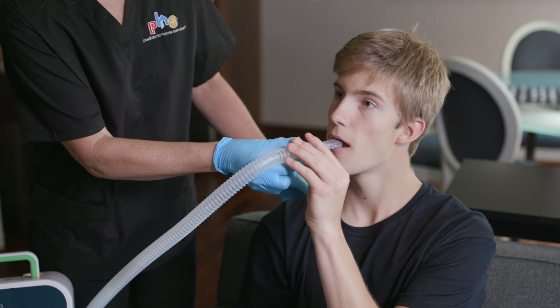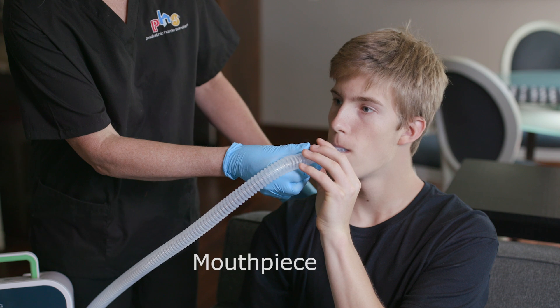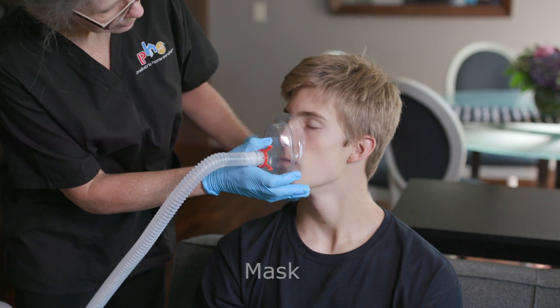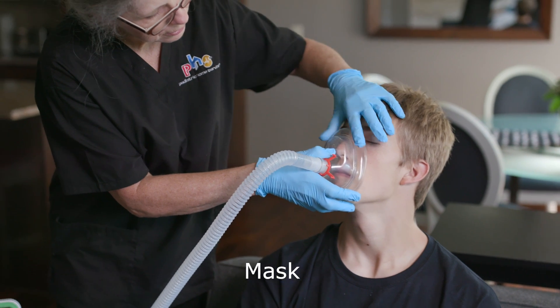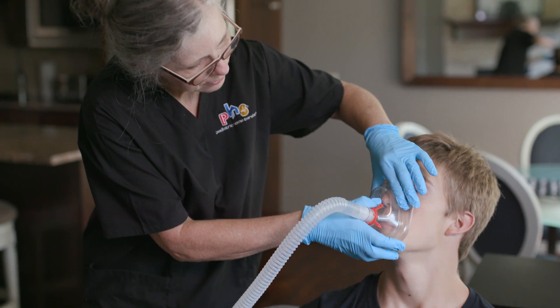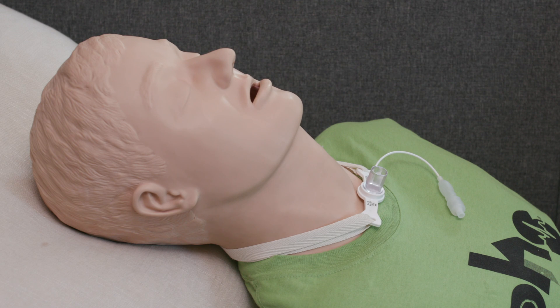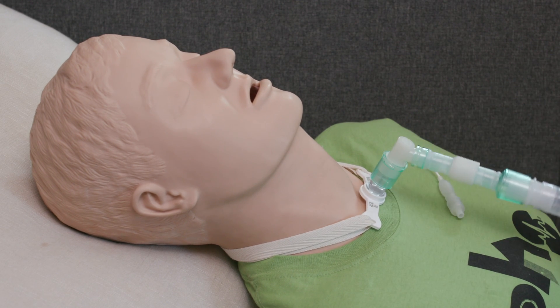If the patient does not use a trach tube, put the mouthpiece or mask on the patient. If using a mask, make sure the patient's chin is up and the mask forms a tight seal on the face. If the patient has a tracheostomy, attach the adapter to the trach tube.